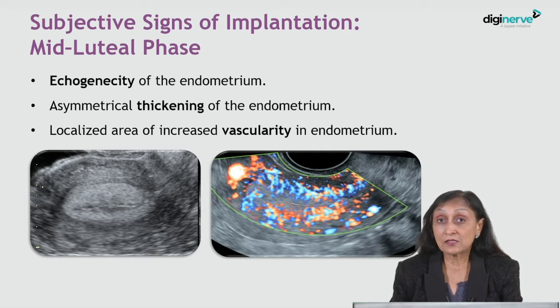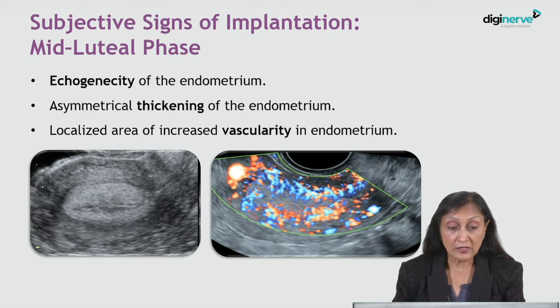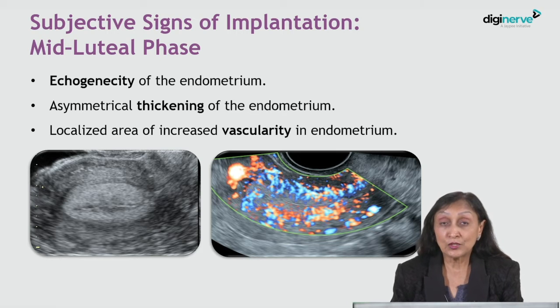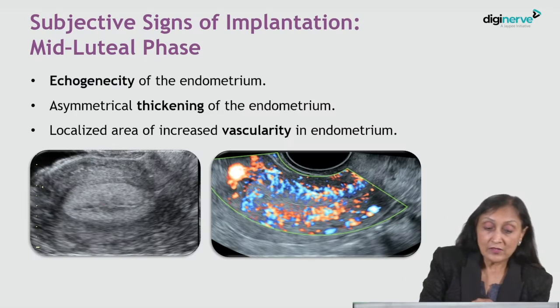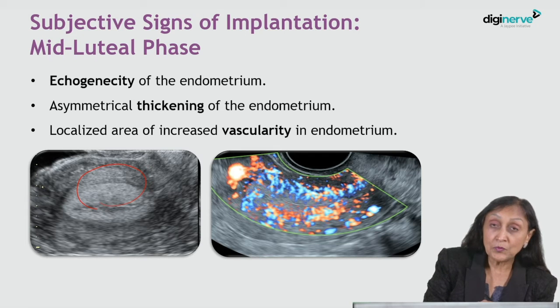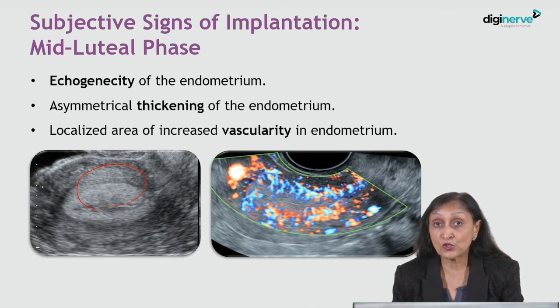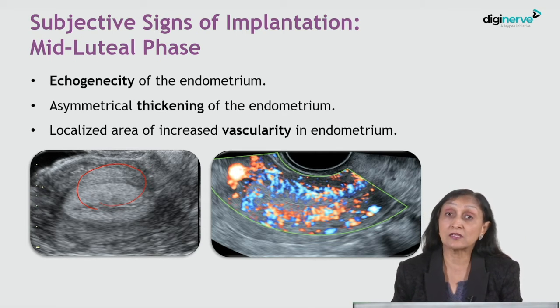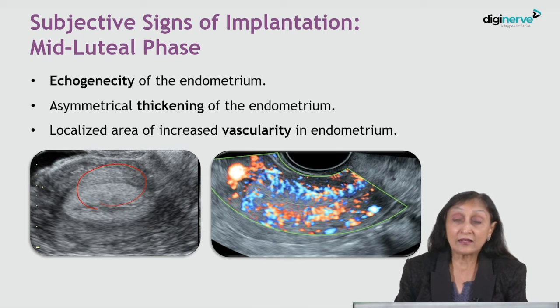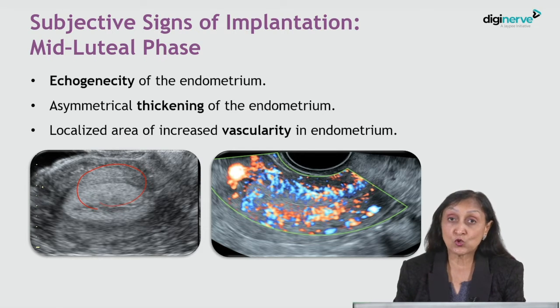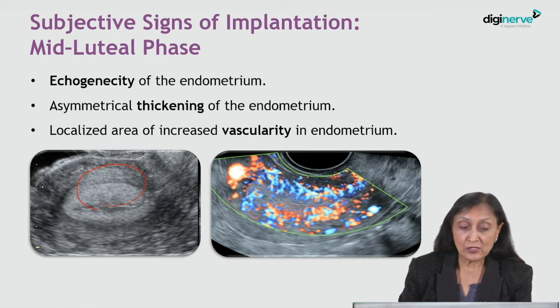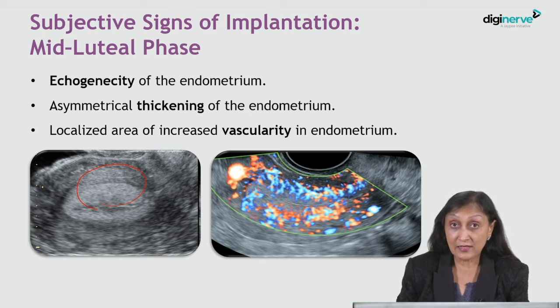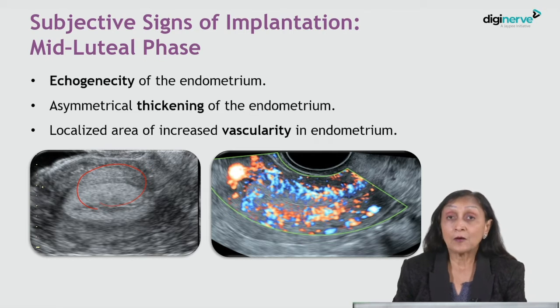The subjective signs of implantation can be seen in the uterus. There is asymmetrical thickening of the endometrium, asymmetrical hyperechogenicity in the same area which is asymmetrically thick, and it is this part of the endometrium which also shows increased vascularity — a localized area which is the site where the embryo is implanting.